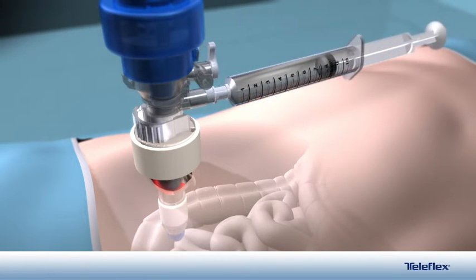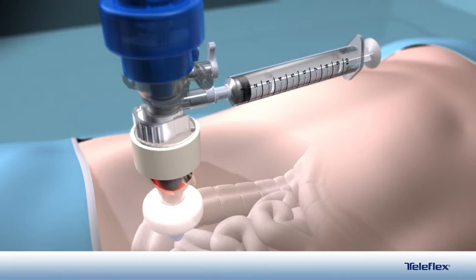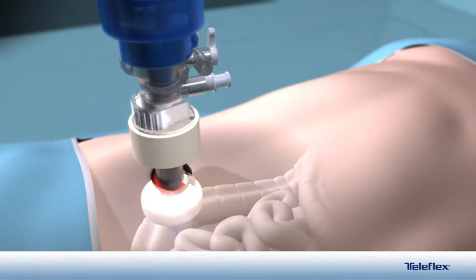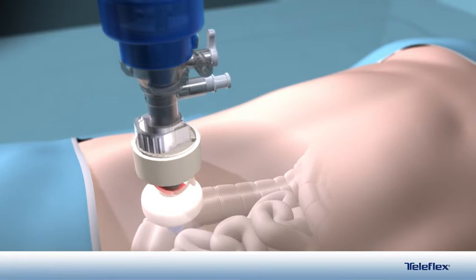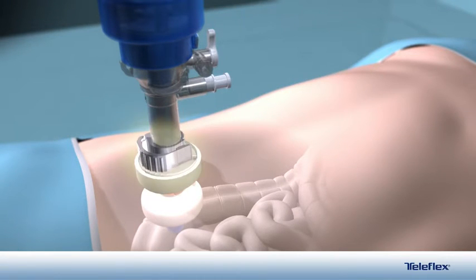Now you may inflate the balloon with 10 cc sterile fluid. Take notice of the foam seal. With one hand, you may secure the foam seal in position by locking the ring clamp.